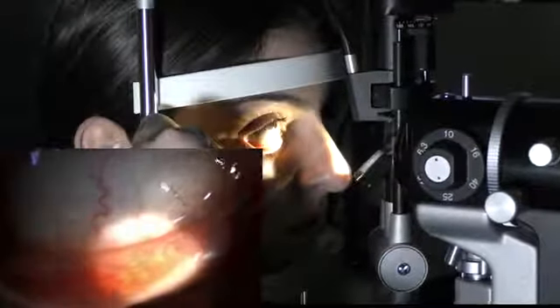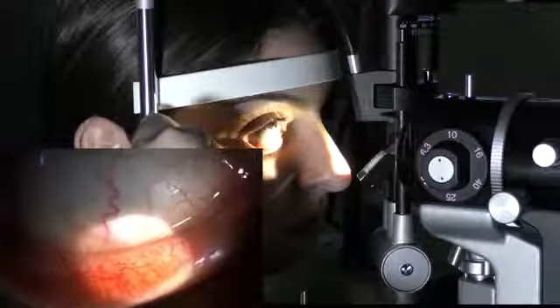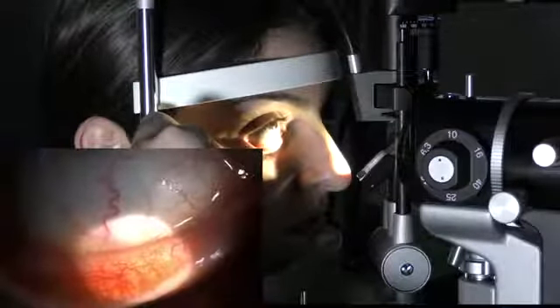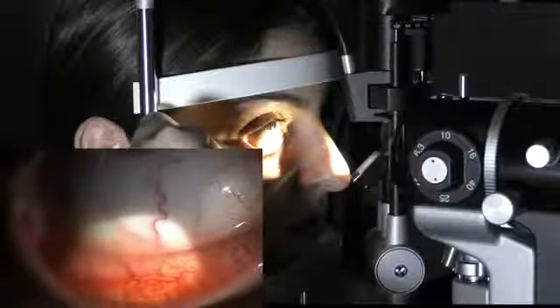You can move across. Very important to look here, especially in a patient with viral conjunctivitis, because you can actually see little follicles and papillae. And especially if you put fluorescein dye, those follicles or papillae can light up and you can get a good appreciation of those. So important to look at that during your exam, okay? And look for any lesions here as well as you make your way to the sclera.